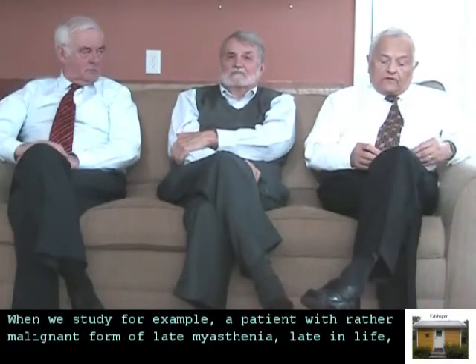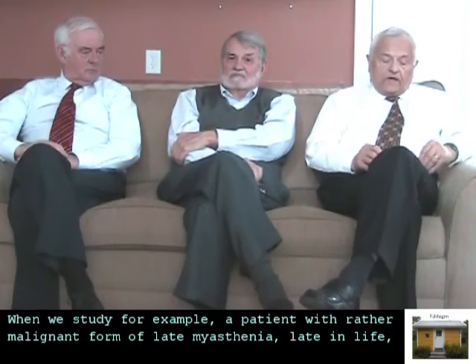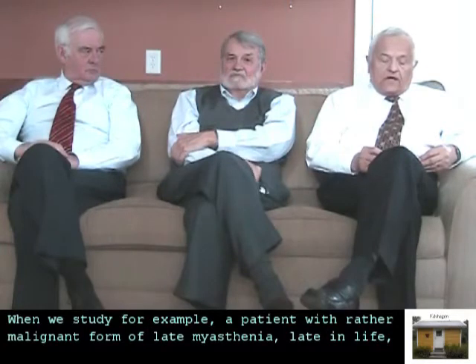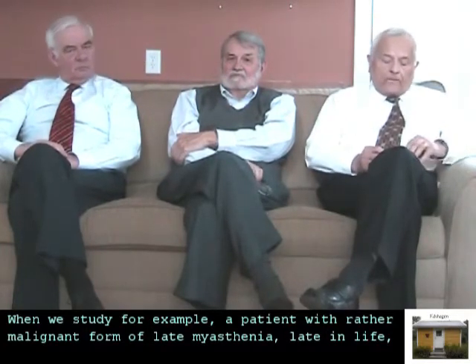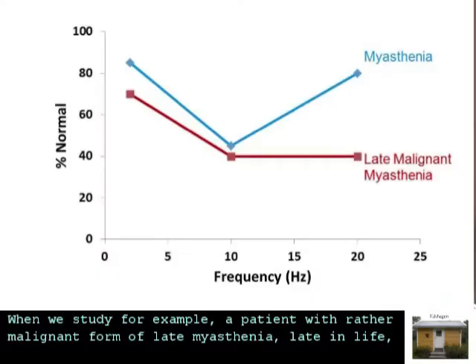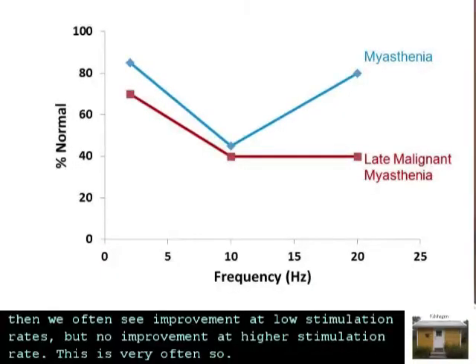When we study, for example, a patient with a rather malignant form of myasthenia late in life, then we often see improvement at low stimulation rates, but no improvement at higher stimulation rates. This is very often so.